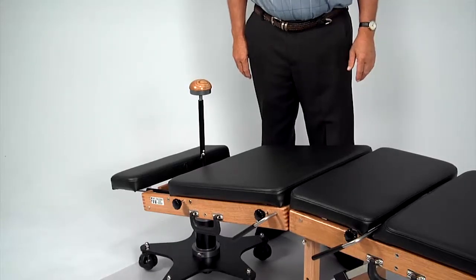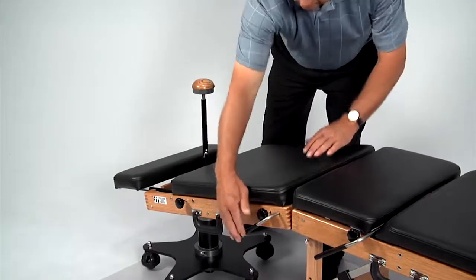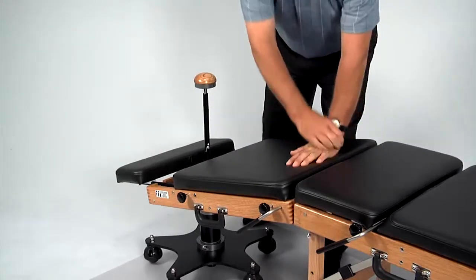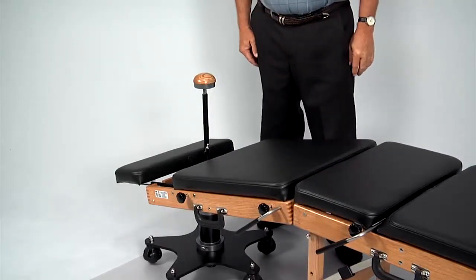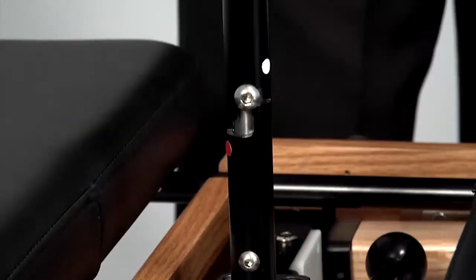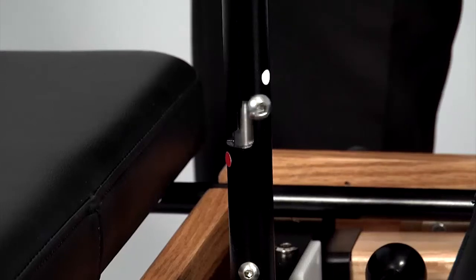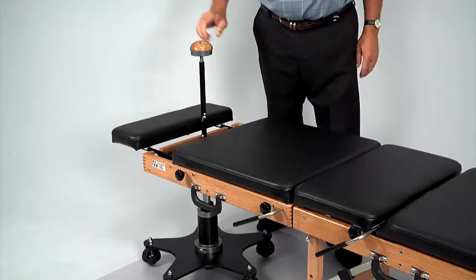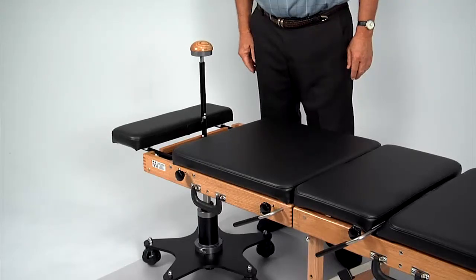The caudal drop can be operated no matter where the table is in the flexion arc. To return the table to its neutral position, turn the control knob so the button is in the red position and allow the gas spring to lift the table back to level. Be sure to return the button to the white position when not using the flexion distraction.